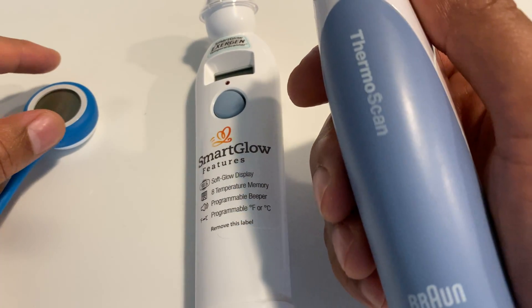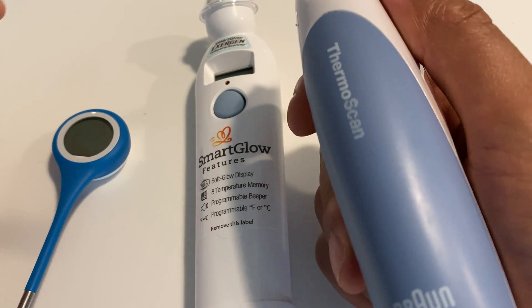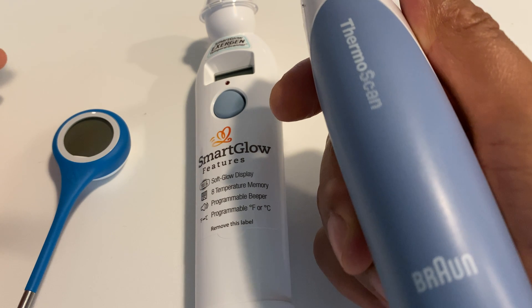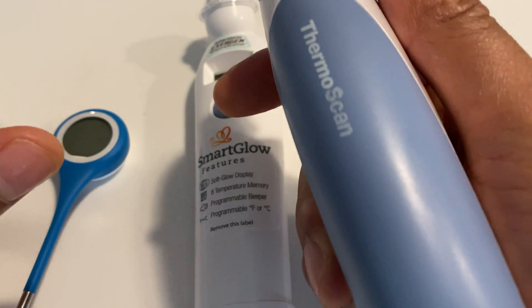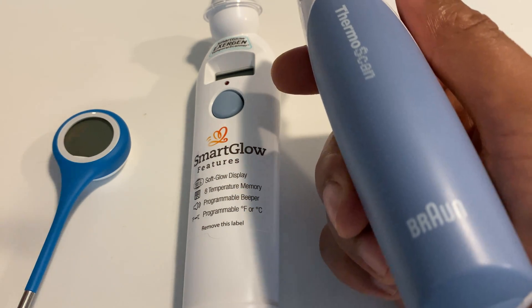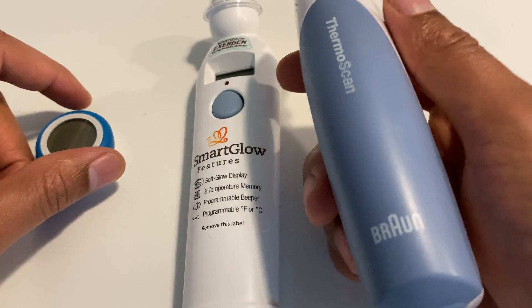Today I'm going to talk to you about the differences between three highly popular thermometers. During this current situation the world is going through right now, thermometers are in high demand along with other types of things like respiratory masks and all that. But let's talk about it.